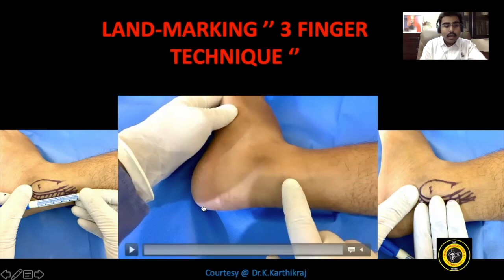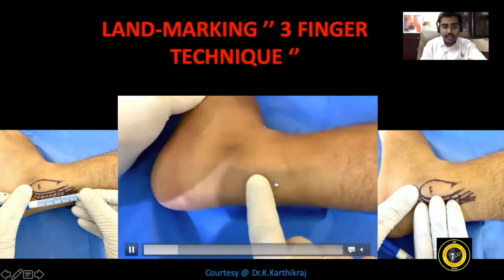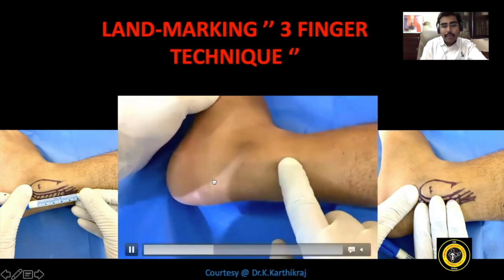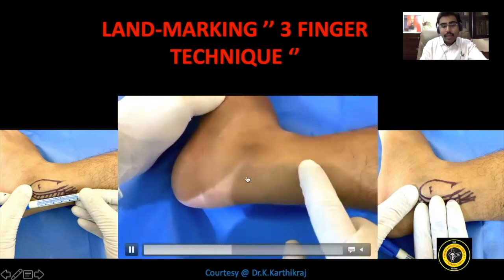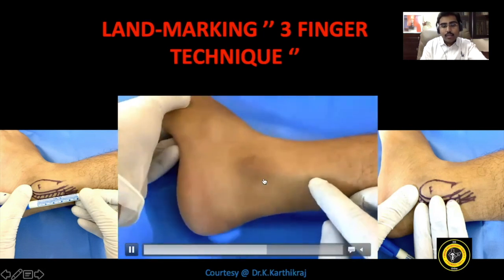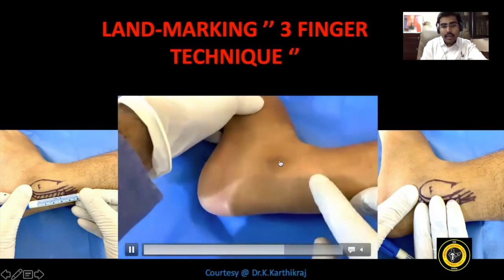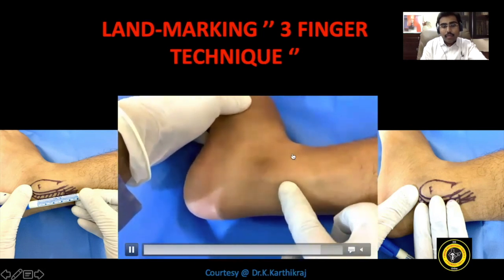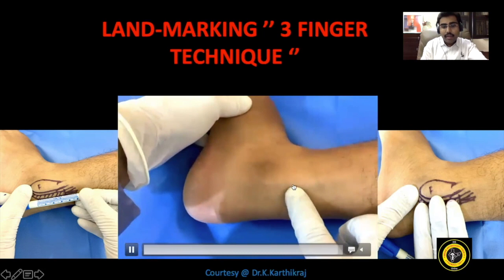You see here? Now, what is important in this understanding? Where to start the incision, especially to make the incision as small as possible. So now what I'm trying to palpate here is you can palpate very easily that in the retromalleolar region, it is more of a single bundle. And to make it advantaged while taking the foot into plantar flexion, you can see the point where I'm trying to palpate, beyond which you see the tendon splitting or coming out of the tunnel.